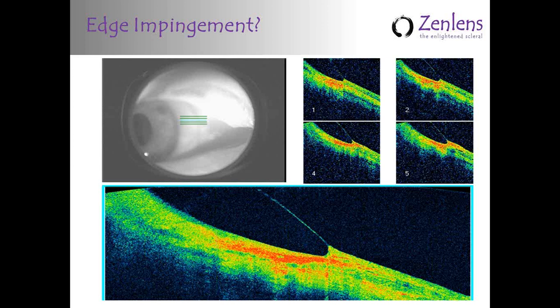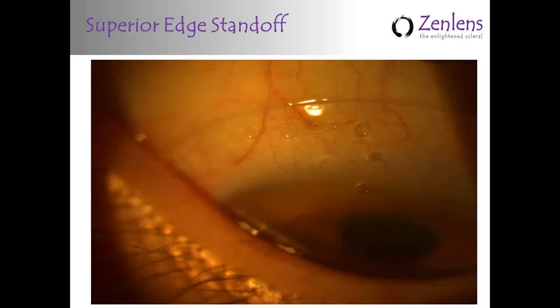If you're looking at a lens, sometimes the practitioners will say, it looked okay, it might have been a little steep, a little tight, or a little flat. That's the scenario where I think you're safe if you just make a one-step adjustment. 30 microns, so maybe ease your mind a little from what you were seeing, and a 30 micron adjustment is certainly safe. I think patients aren't likely going to notice a difference in how the lens feels. And of course, patient comfort is another means of evaluating.